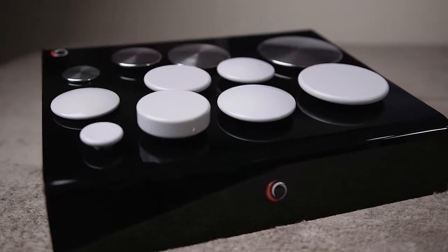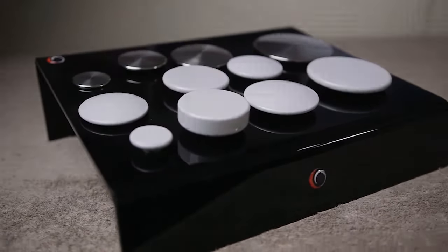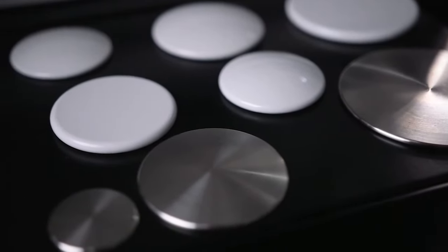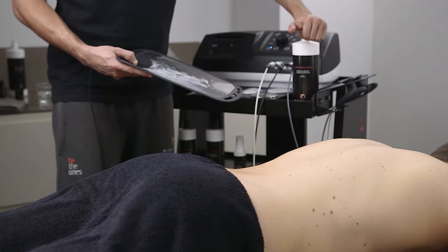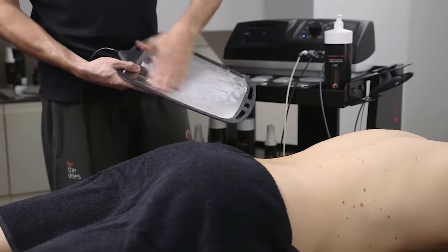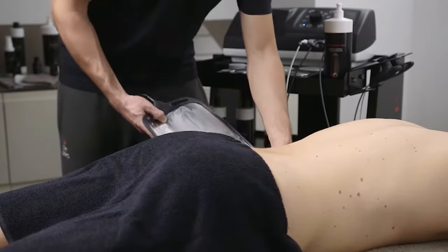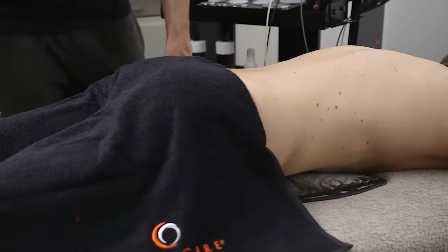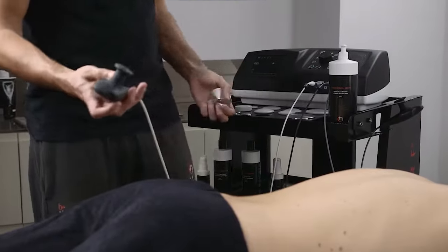The electro set supplied with T Plus, with wide variability in the shapes and in the materials used, maximizes the power of the generator. Every detail is developed to maximize efficiency, so the plate surface of contact is designed to allow energy to reach the deepest tissues. The ergonomics of the end pieces and the electromagnetic attachment system make it easy to apply the instrument, minimizing the effort of the therapist.